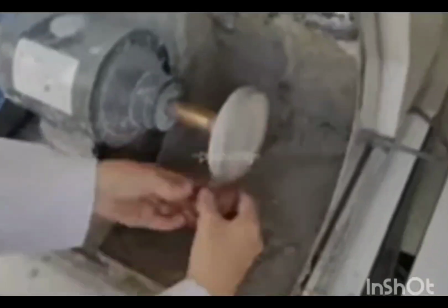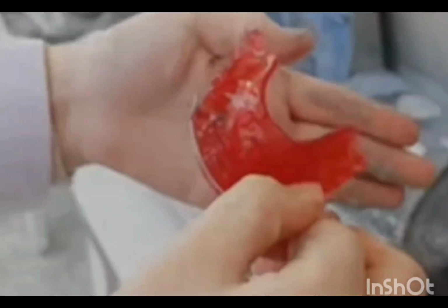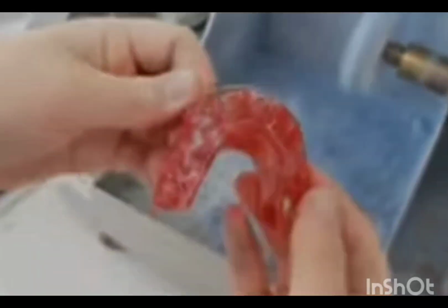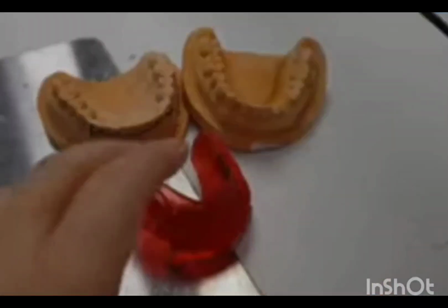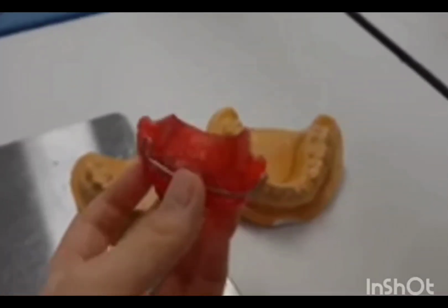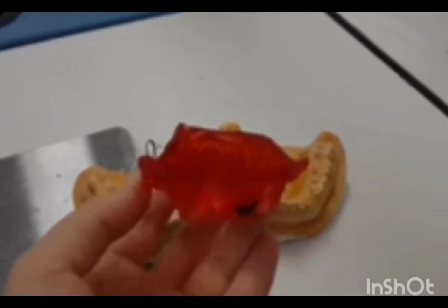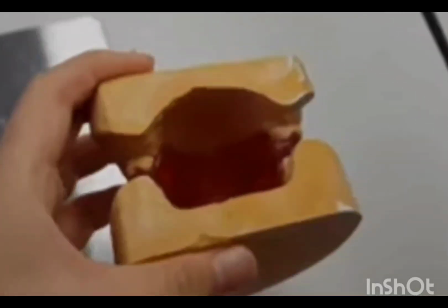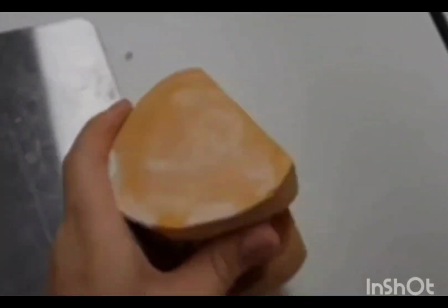Now we'll proceed to finishing and polishing. This is what the appliance looks like after the finishing and polishing. Now let's try it on the cast and see how it looks. This is how it fits. I hope it's clear now.